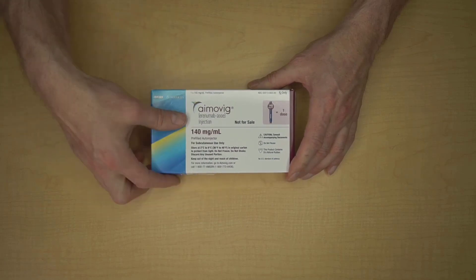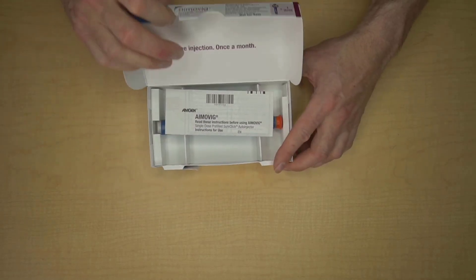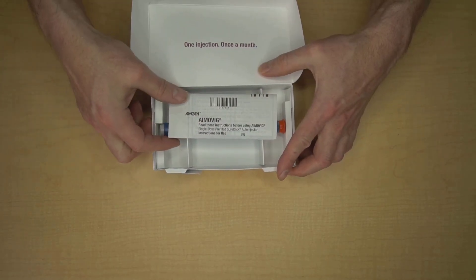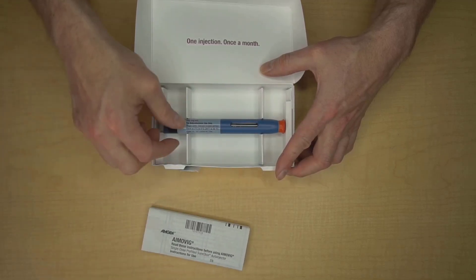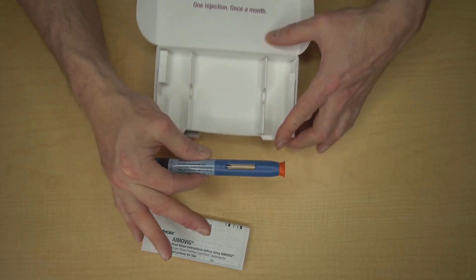So here's the Amovig box, and it's usually sealed somewhere along the front. This is the prescribing information, which is really useful and probably worth a read. And then when you get the Amovig, just lift it straight up out of the box.